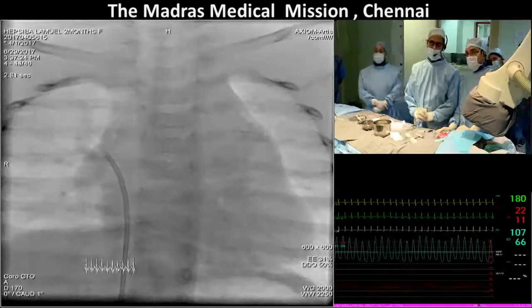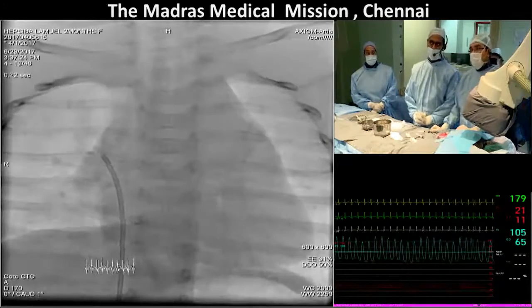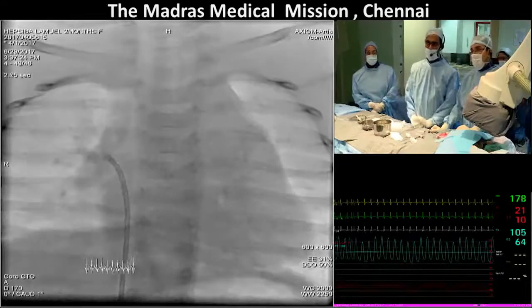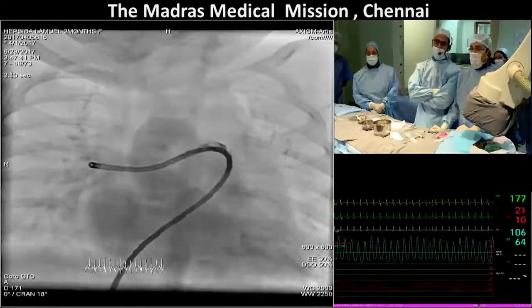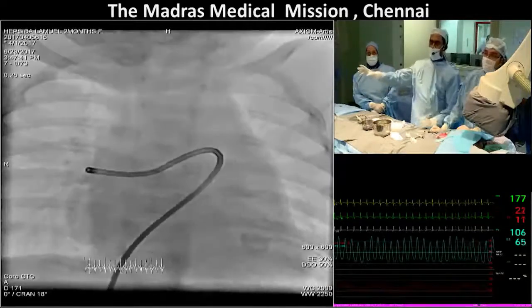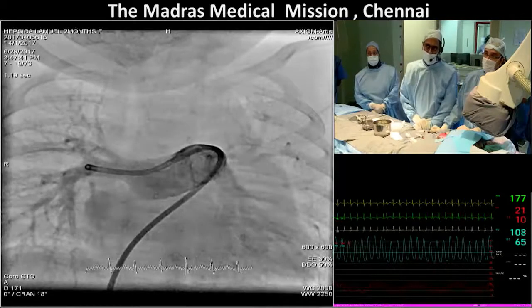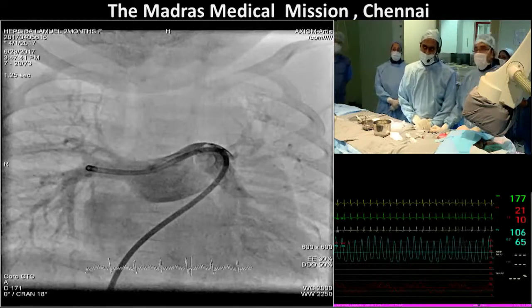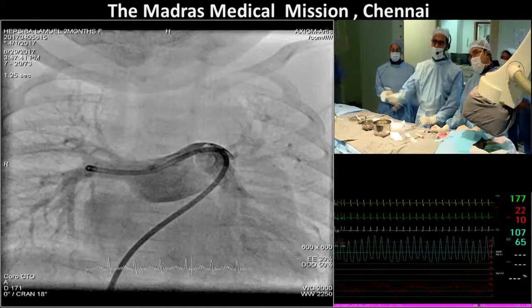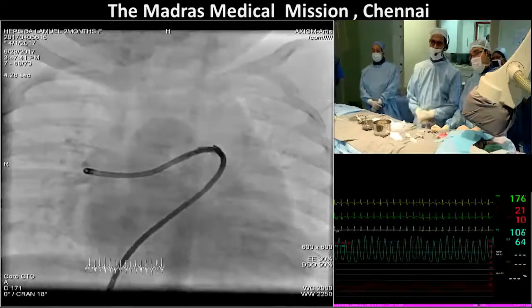However, the portion of the left atrium near the region of the right pulmonary veins was aneurysmal. Next picture. So then we took a catheter into the main pulmonary artery, freeze the frame. So we can appreciate the whole of the main pulmonary artery significantly dilated, and from the lower surface of the right pulmonary artery, there is a communication that goes and fills the left atrium.